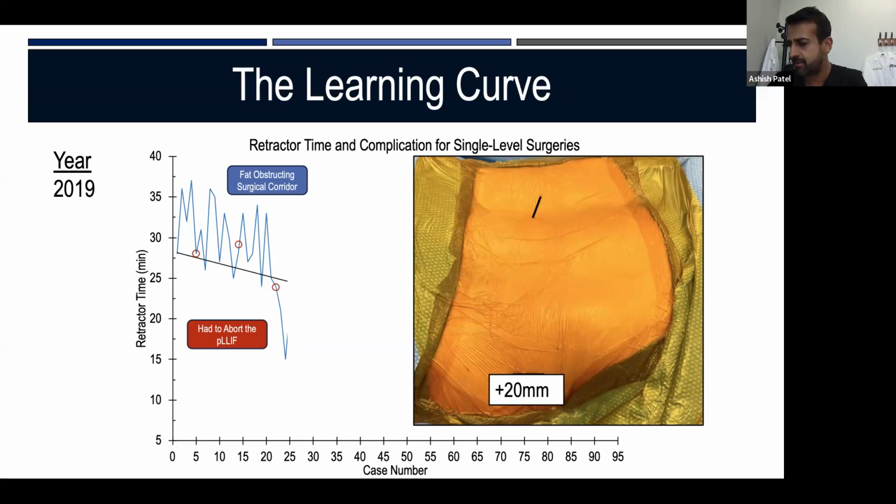Have you seen that too, Mike? Yeah, agree, 100%. You have to have slightly longer blades, and there are some patients that early in the experience I just realized that we couldn't do prone on because we didn't have long enough blades.